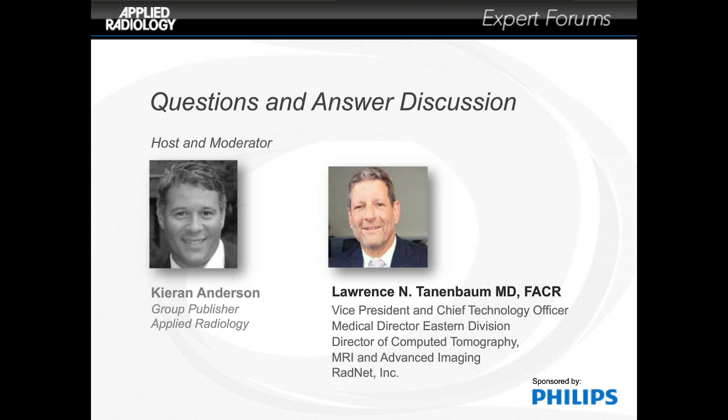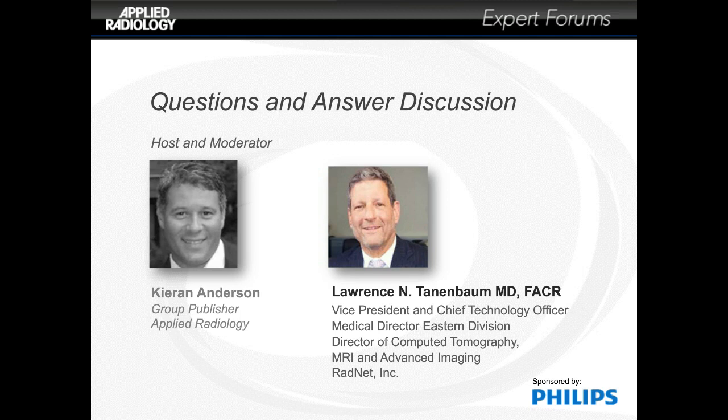Thanks, Dr. Tanenbaum. You talked a fair bit about some of the CT findings for COVID-19 disease. In your opinion, are there any clinical indications for the use of MR as well? You know, I think in terms of screening for the classic manifestations of the lung disease, CT's really well suited to this. It's fast and it's entirely diagnostic.